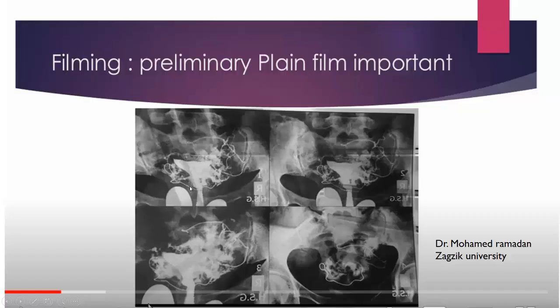This was a hysterosalpingography, but no preliminary film was taken, and there is some mist-like shadow here, and irregularities are present here all through. So please take a preliminary plain film.